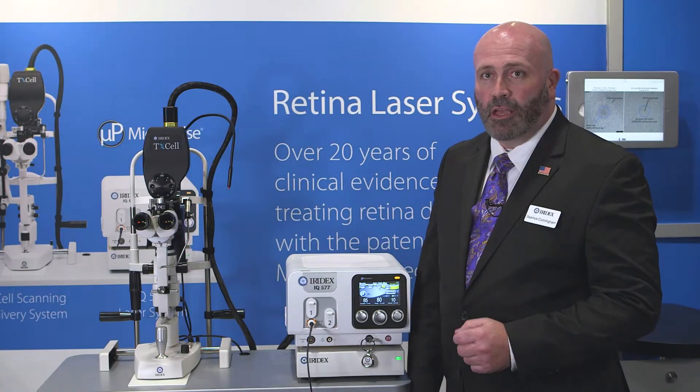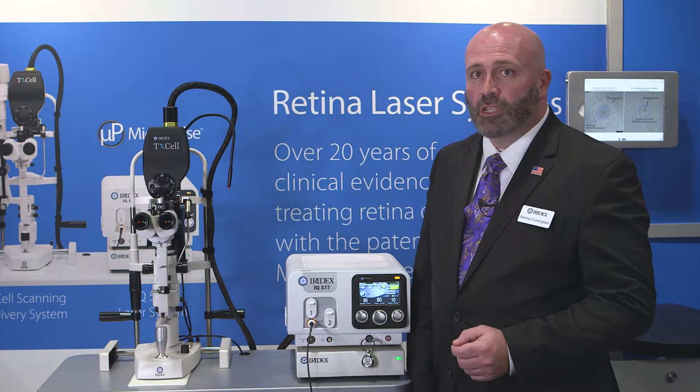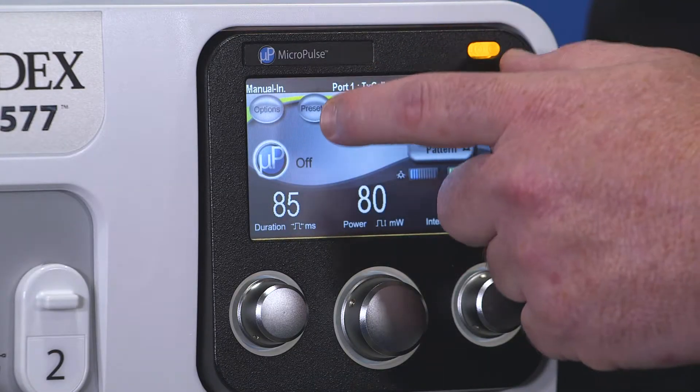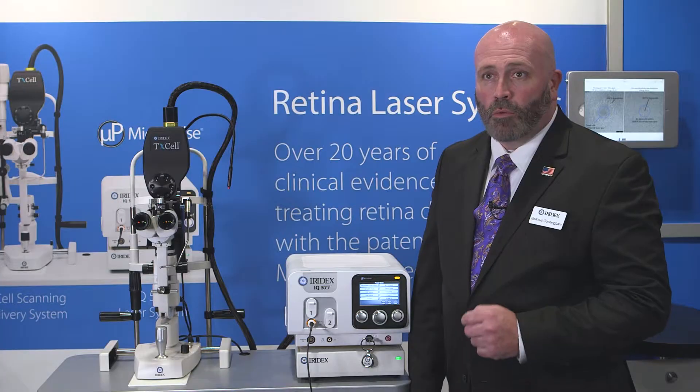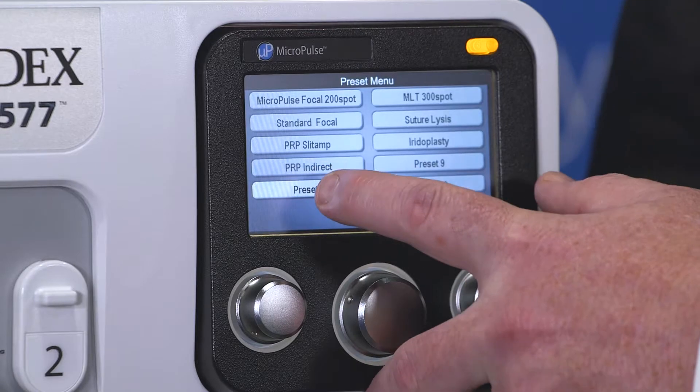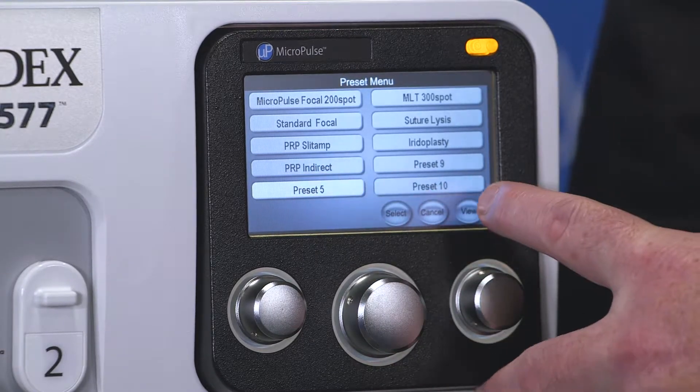To program a preset on the IQ series laser, you first need to open the preset menu by touching the icon at the top of the screen. Once that's open, you can select the preset that you would like to program. Here we'll select preset 5 and press View.